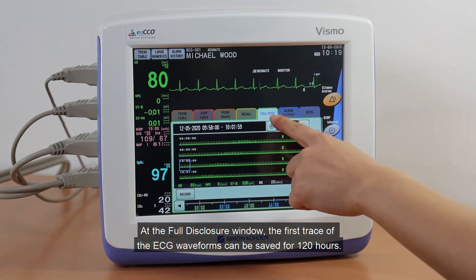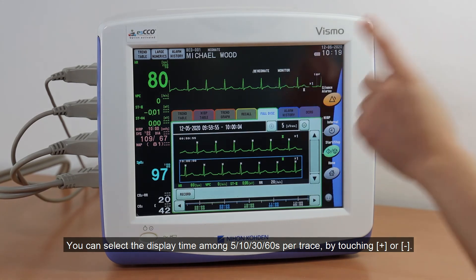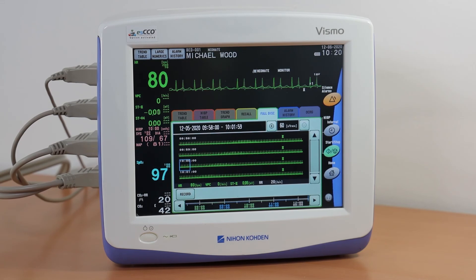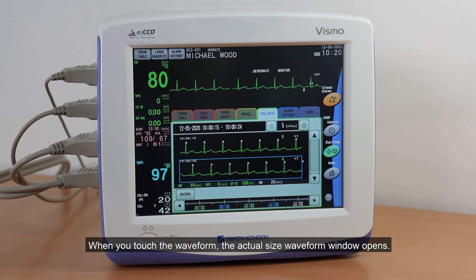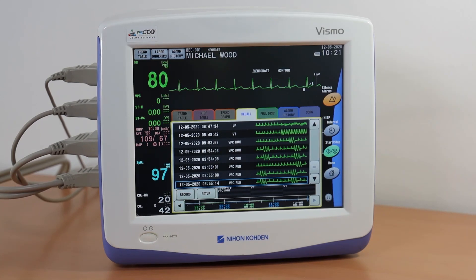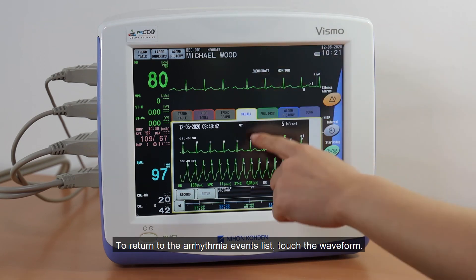At the Full Disclosure window, the first trace of the ECG waveforms can be saved for 120 hours. You can select display time among 5, 10, 30, or 60 seconds per trace by touching Plus or Minus. When you touch the waveform, the Actual Size waveform window opens. At the Recall window, you can see the Arrhythmia events list with ECG waveforms. You can see the actual waveform size by touching an Arrhythmia Recall event item. To return to the Arrhythmia events list, touch the waveform.